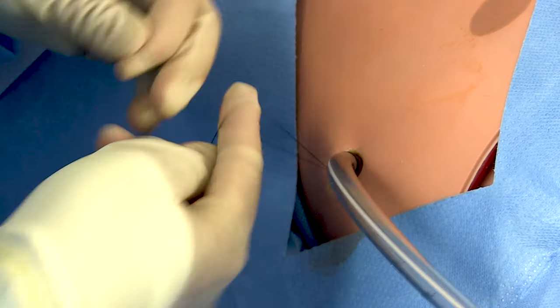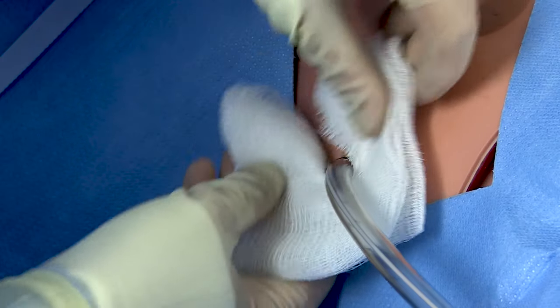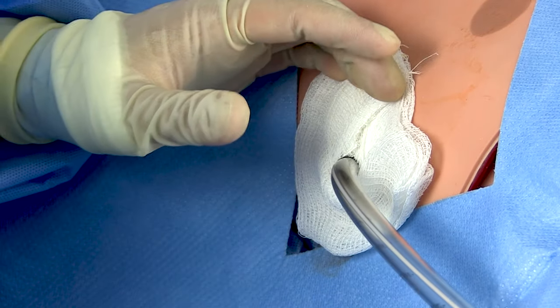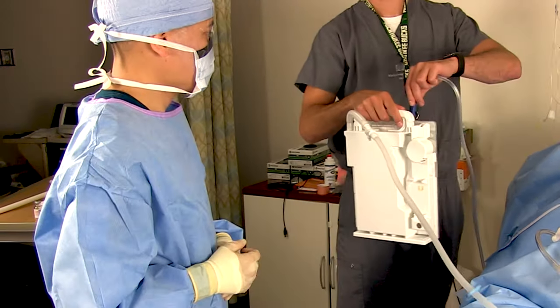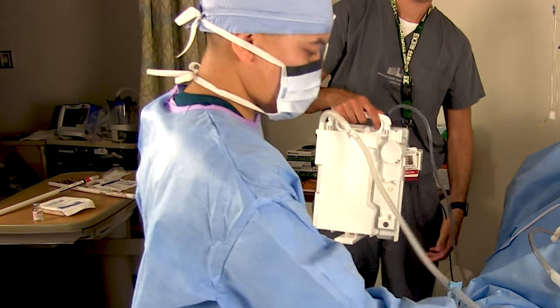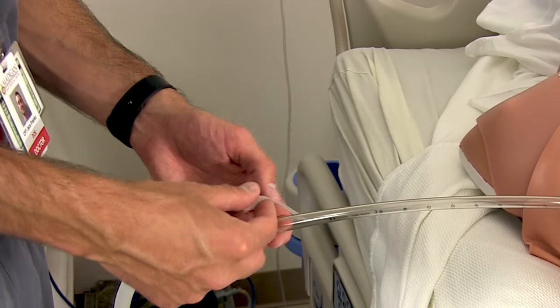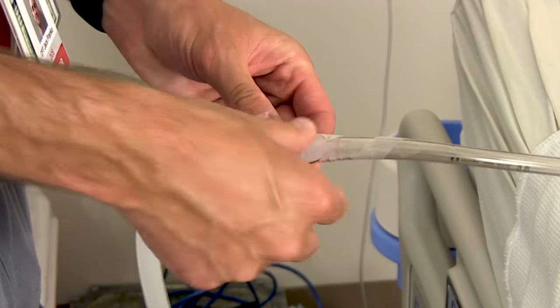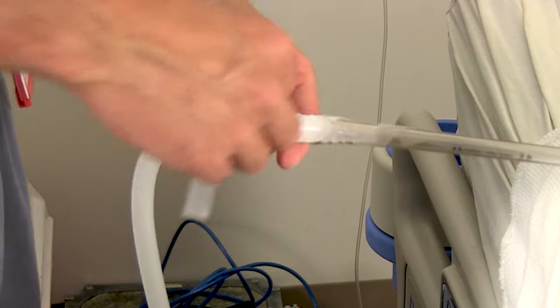Now you can dress the chest tube. Some people will put some Xeroform over it before applying a little gauze sponge — just cut a little slit in that gauze. Then apply your tape of choice; a lot of people like foam tape for this. Hand the Atrium to a bedside nurse or assistant to hook it up to wall suction, clean up your sharps, and get the drapes off. Remember to reinforce the Christmas tree connections with tape. Notice here Dr. Franco is using skinny strips of tape spiraled around the connection, using a few strips rather than one thick wad — that way you can still see the actual connection if you need to troubleshoot it.